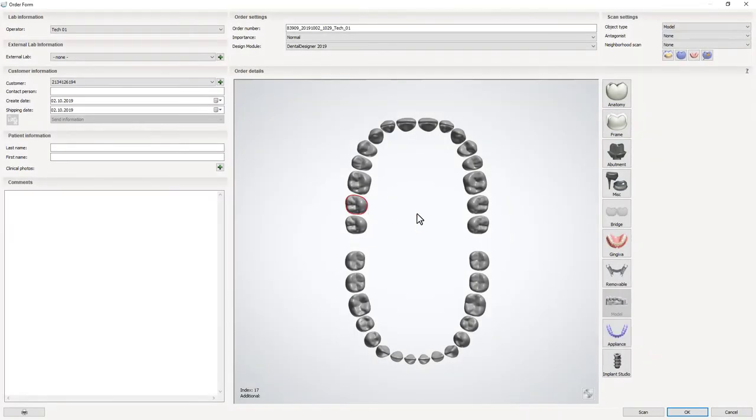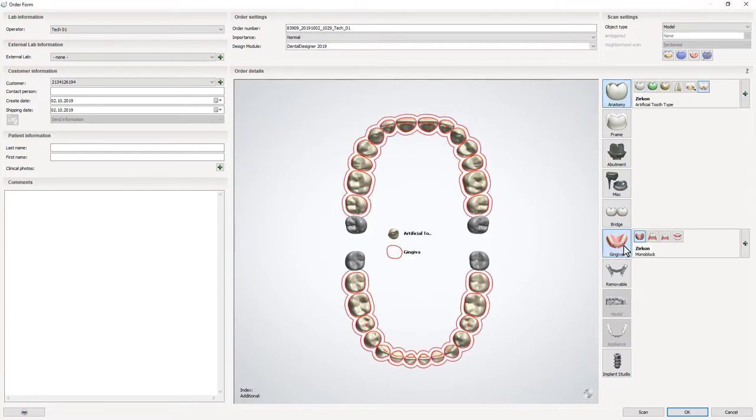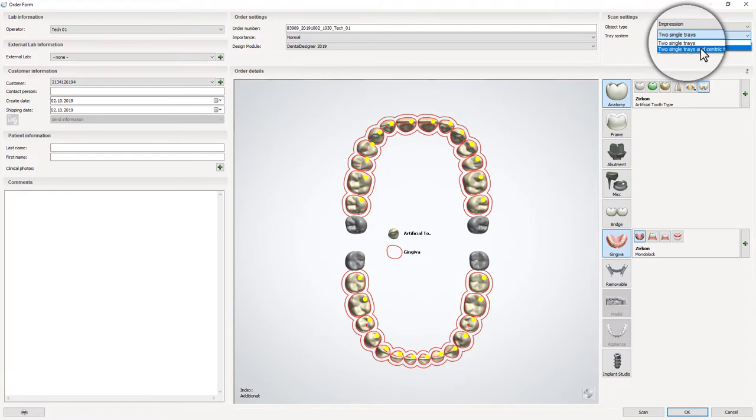Start by creating an order form. From the order details, choose both jaws. Select Impression as an object type, and two single trays and Centric Tray as a tray system.